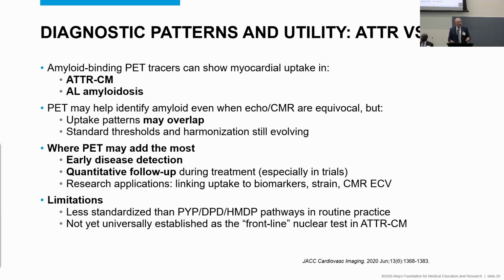And what does it add the most? It potentially allows earlier disease detection. The conversation we always have is that if you wait until later in the disease and you start therapy, the patients don't do as well, right? So the earlier the therapy, the better the outcome. If you have a tracer that allows us to pick up the disease earlier and initiate therapy earlier, potentially the patient does better. And the beauty of it is you can quantify this and have long-term follow-up.